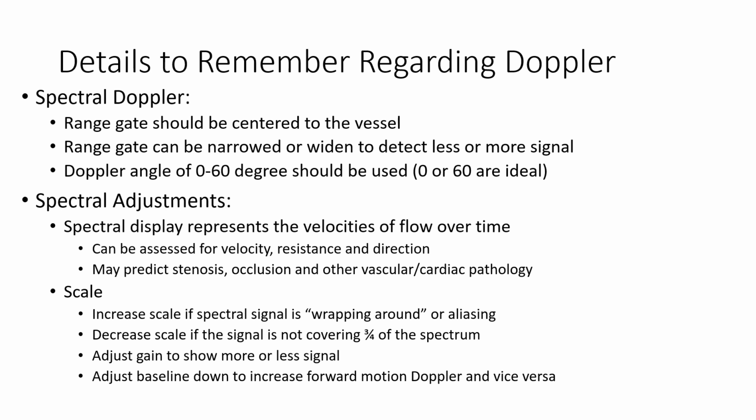Now, if you happen to have a waveform that's wrapping around, or it's going off the top of the scale and peaking at the bottom of the scale, that would indicate there's an aliasing, and you would want to increase your scale in that case.